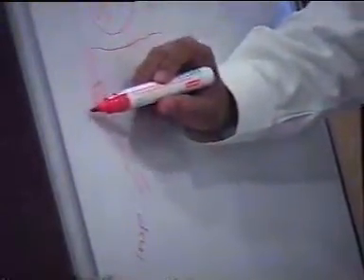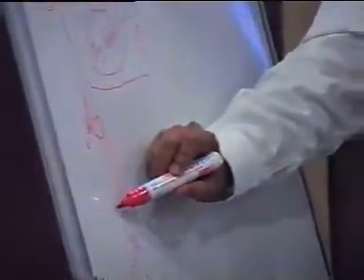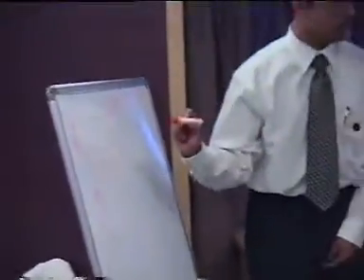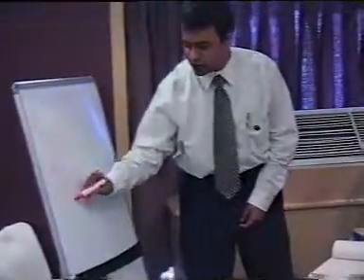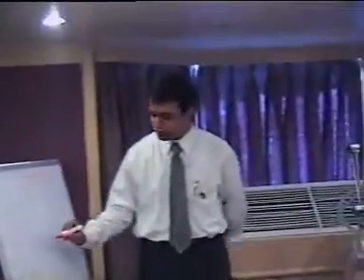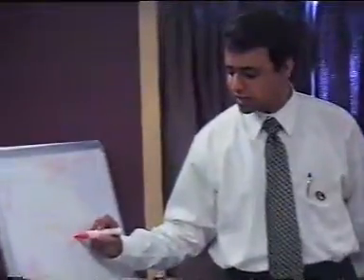This goes into the inspiratory limb of the patient. This is known as the inspiratory limb of the patient, and you have to monitor this area with the help of a manometer. And because it is pressure delivered during inspiration, it is known as peak inspiratory pressure. You got this till now. Then you have the patient connecting device, let's say the endotracheal tube, from which you have an exhalation limb going. Visible from there, no? No problem till now. But you don't have an exhalation limb, you have a smart valve over here, and that is known as the expiratory valve.